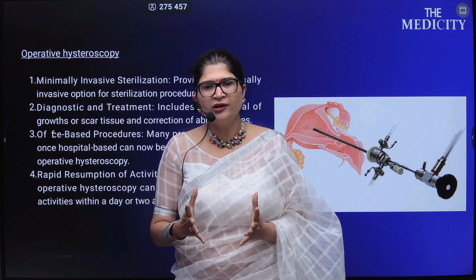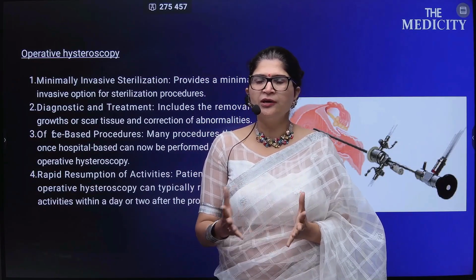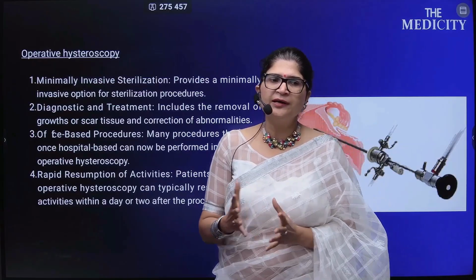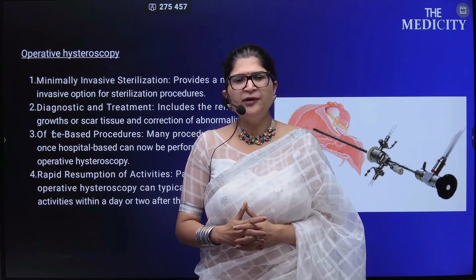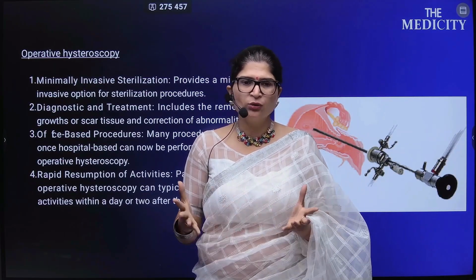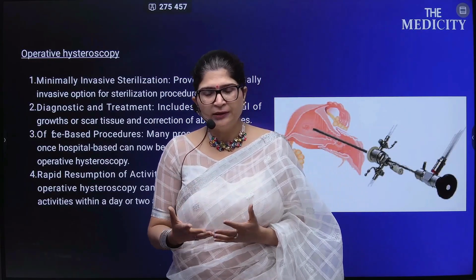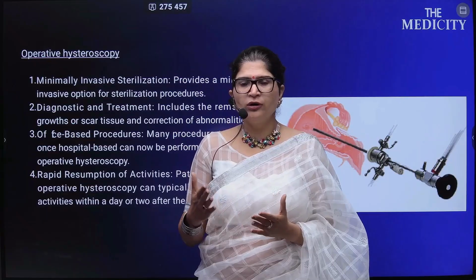Office-based procedures can even be performed, in the office setting or the OPD setting, as we say. Smaller procedures can even be attempted in the OPD. There is a rapid resumption of activities. Patients undergoing operative hysteroscopy specifically might be discharged in daycare or a day after.